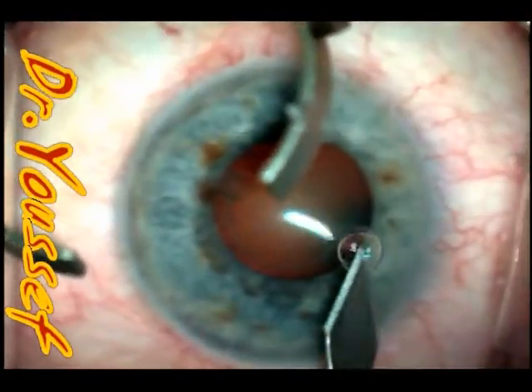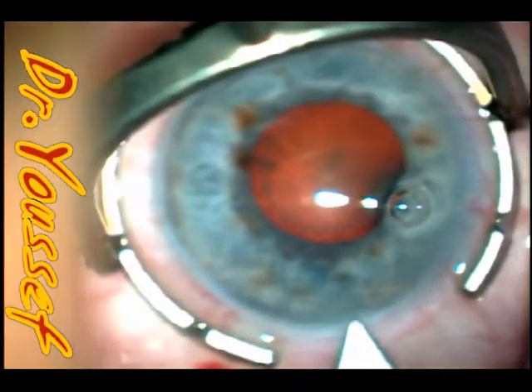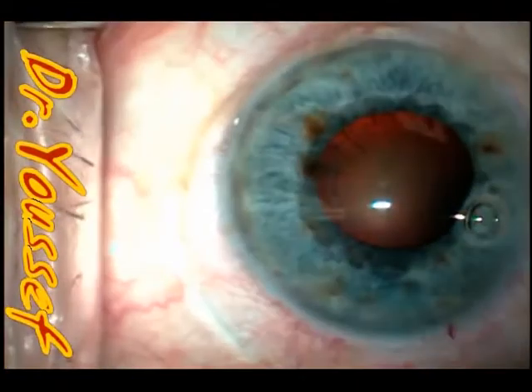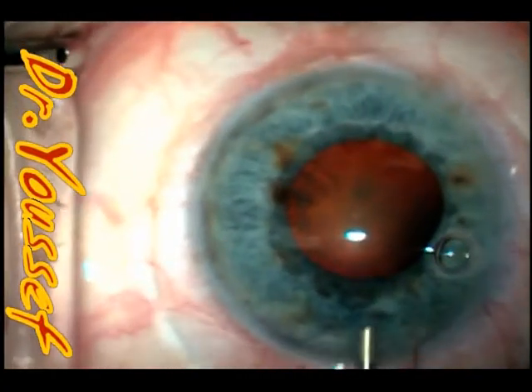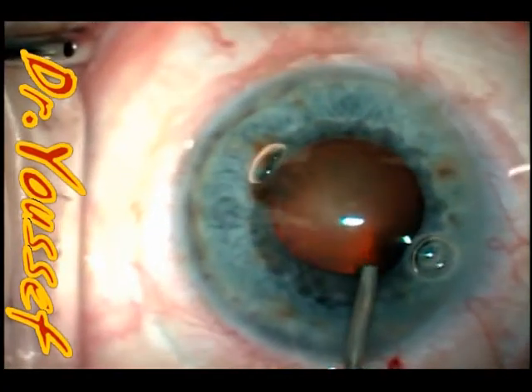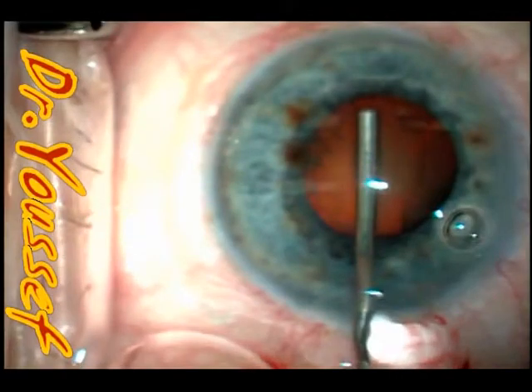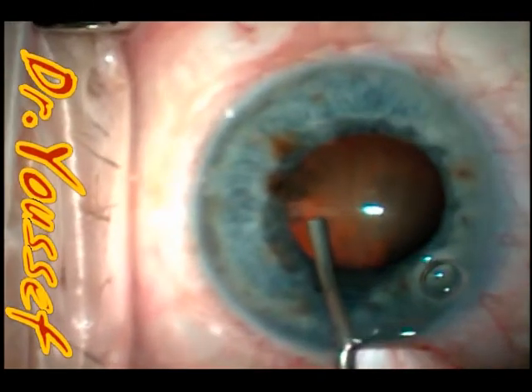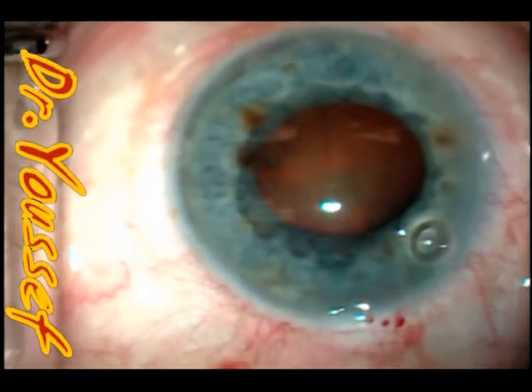Good morning, I'm Dr. Youssef and I'll be presenting this case of pseudoexfoliation with small pupil. She had a cortical and nuclear cataract and the pupil was about four millimeters in size and she had a shallow chamber. So I don't want to implant the Malyugin pupil expansion ring and I try to avoid as much as I can the use of flexible retractors, as it creates about four or five extra wounds in the eye and takes time to implant. If I can do it without, I will.